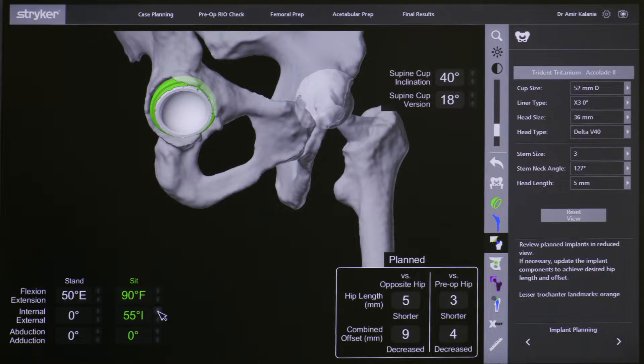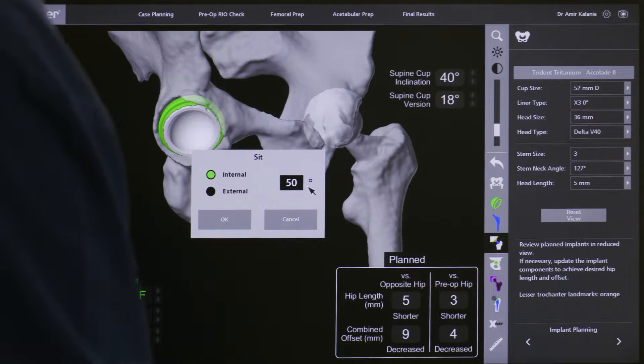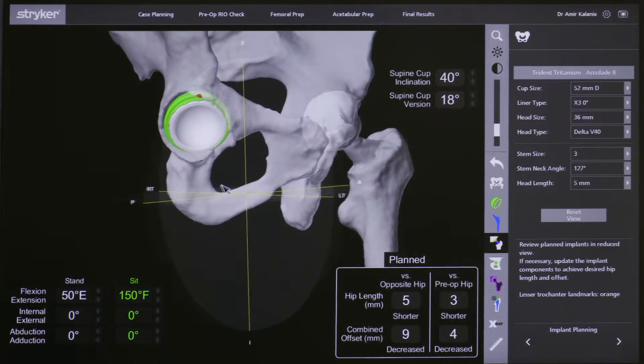Here we bring the hip into flexion. The red areas denote areas of impingement which can cause posterior dislocation. There is a bony osteophyte at the front which I will remove during the operation. We are putting the hip into 150 degrees of flexion, confirming the hip can be flexed to 150 degrees without any risk of impingement and potential dislocation.